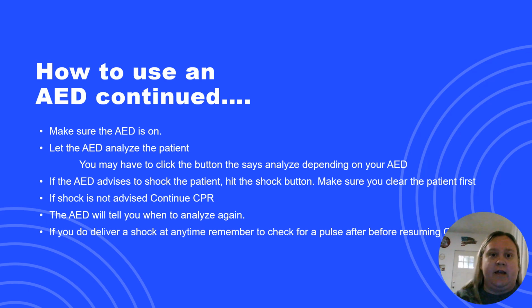The AED will let you know when it's time to reanalyze the patient so that the AED can check the heart rhythm again, see if anything's changed, see if the AED decides it wants to deliver a shock this time, different things. So the AED will tell you when it's time to analyze again.